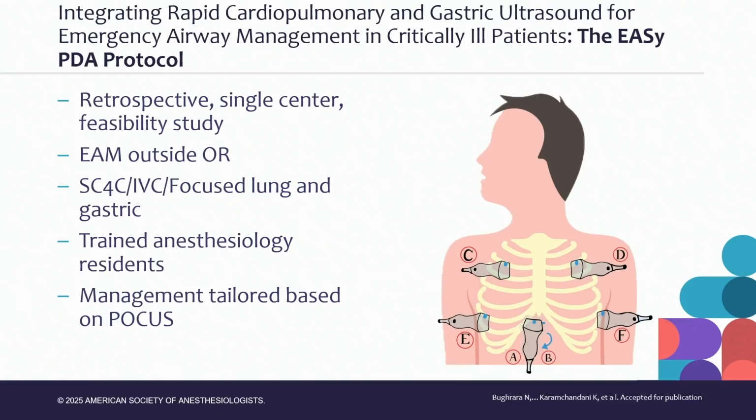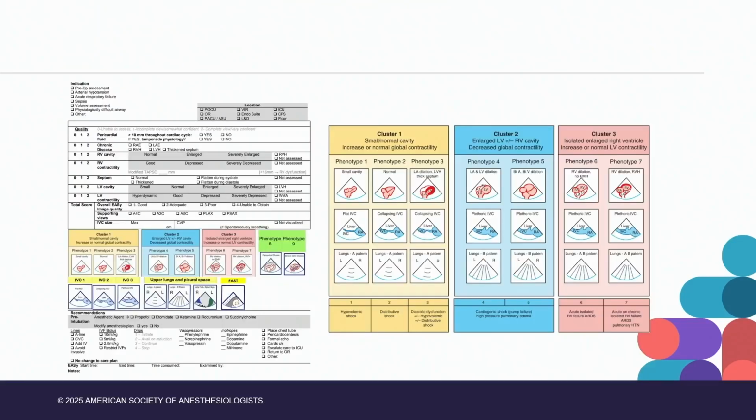This was a retrospective single-center feasibility study. Again, all tracheal intubations occurring outside the OR. These were trained anesthesiology residents. And Nibras is going to spend the next 15 minutes talking about how we train people to do this exam. They were asked to fill a form, identify clusters. Again, Rachel talked about these clusters already, so I'm not going to go into detail.